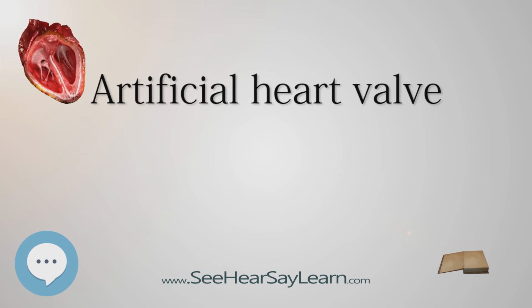Cavitation. Cavitation is an event that can lead to MHV failure. While this has been a relatively rare occurrence, in 1988 the Edwards Duromedics bileaflet had 46 reported failures in 20,000 implants related to cavitation damage. Since then, manufacturers have made cavitation testing an essential part of the design verification process.